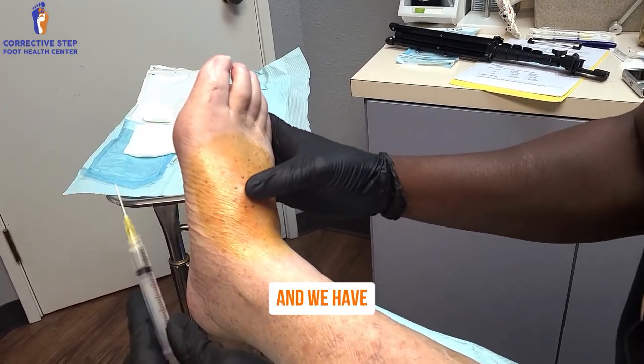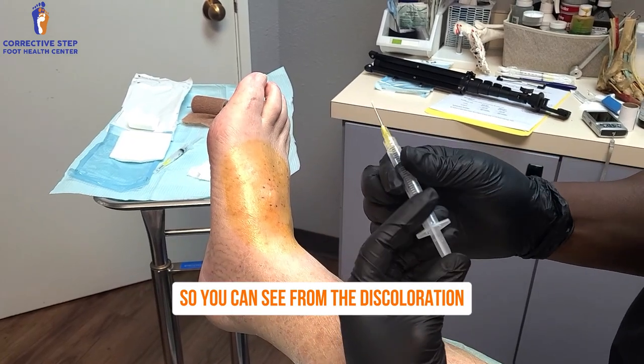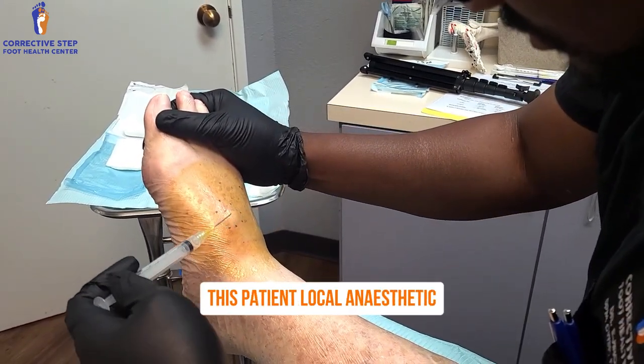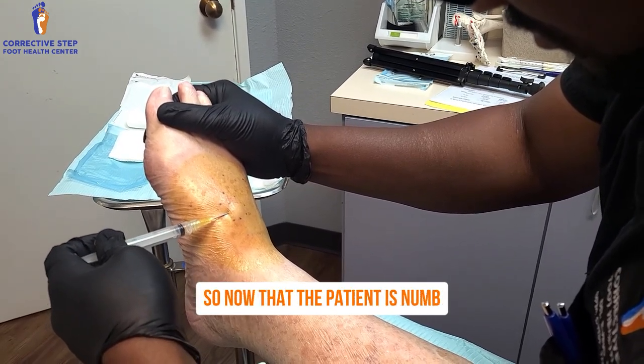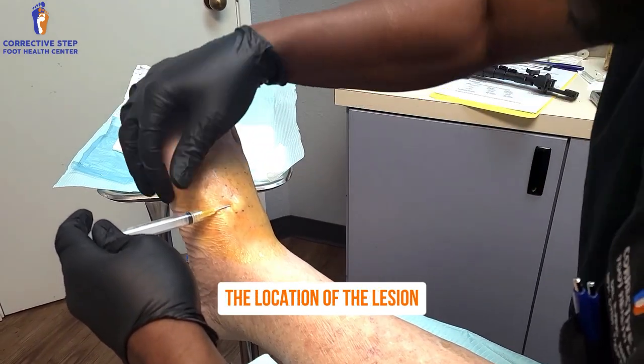Hi, my name is Dr. Edrocero and we have a cyst aspiration. You can see from the discoloration that we've already given this patient local anesthetic, and that discoloration is because we sterilize it with betadine. Now that the patient is numb, you can see we've already marked out the location of the lesion where you see those blue dots.